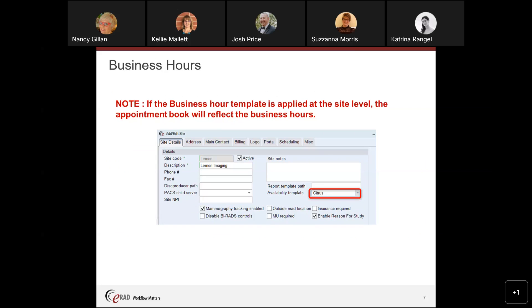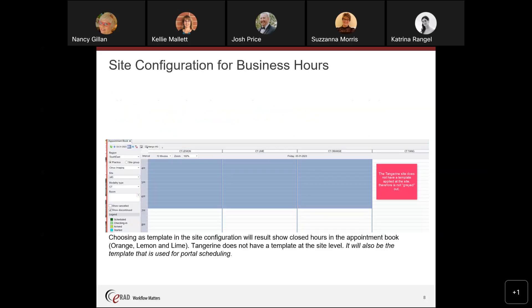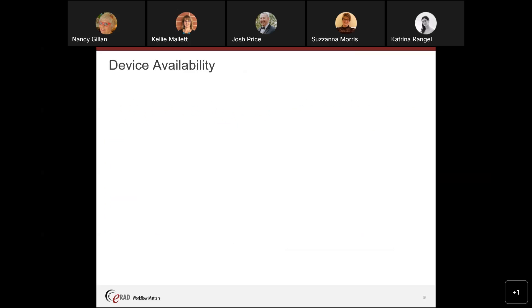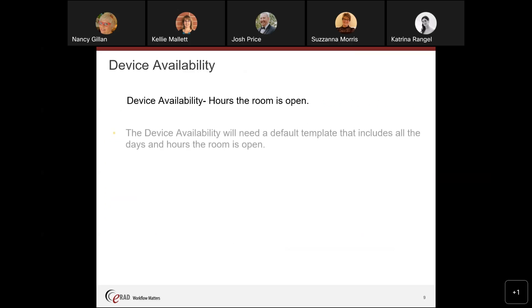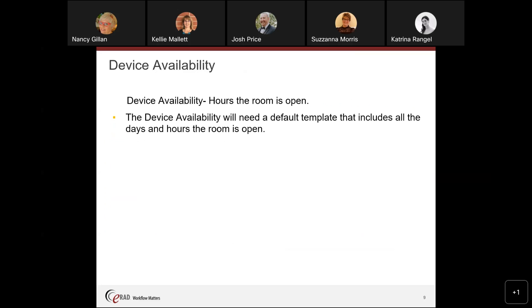Here you can see that the first three rooms — CT Lemon, Lime, and Orange — have the business hours template applied at the site level. Tangerine does not have a template at the site level. This is also the template used for portal scheduling, if you do portal scheduling at your facility. Then we have device availability, which defines when the room with that device in it is open. It will need a default template that includes all the days and hours the room is open.